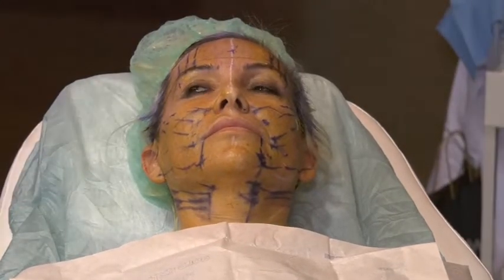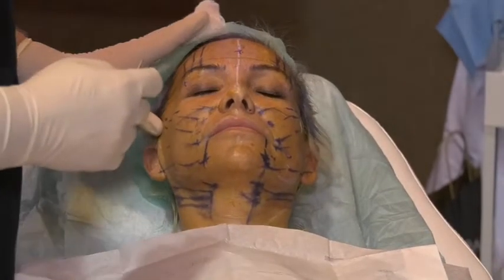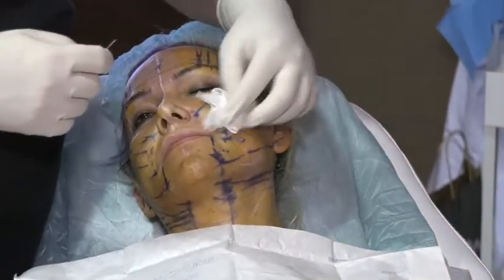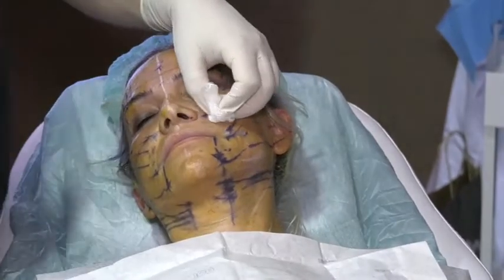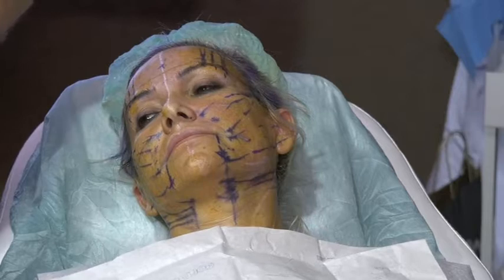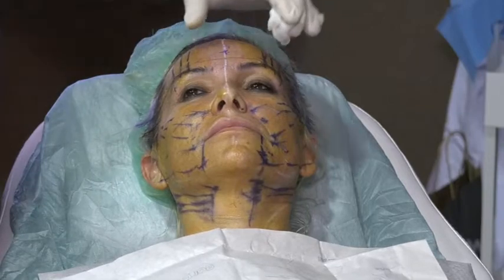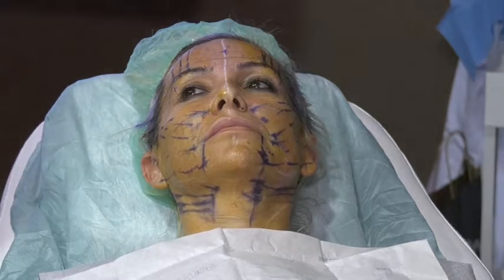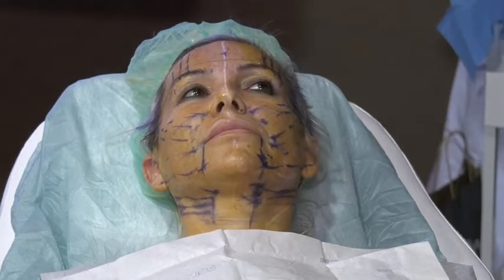We did anesthesia at the entry point and anesthesia at the lateral third of the tract. You put anesthesia here, doctor? Okay, Dr. Abdurrahim added 12 cc of anesthesia, and this is almost eyebrow. We did also anesthesia? Yes, sir. Okay, so 6, 6, 12, and 6, 18. 18 threads, 12 anesthesia is a little down. If we need more, we will prepare one syringe. If we need anesthesia at any level, we will add.